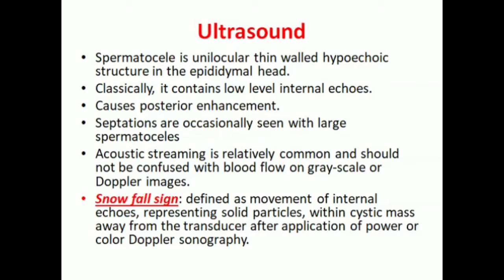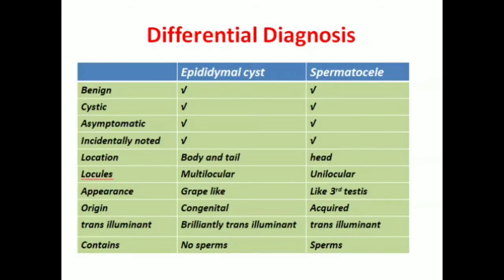Acoustic streaming is relatively common and should not be confused with blood flow on grayscale or Doppler images. The snowfall sign is defined as movement of internal echoes representing solid particles within the cystic mass away from the transducer after application of power or color Doppler sonography.